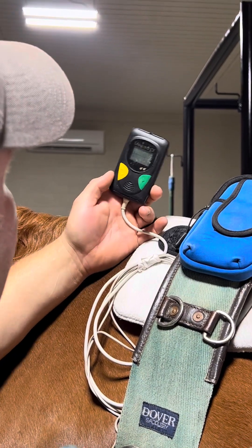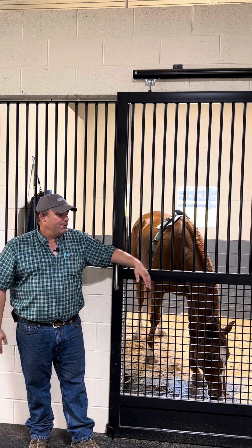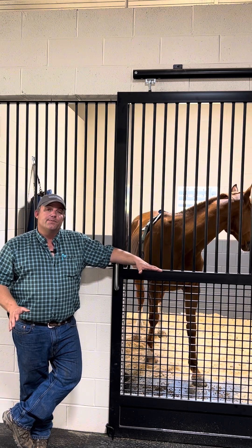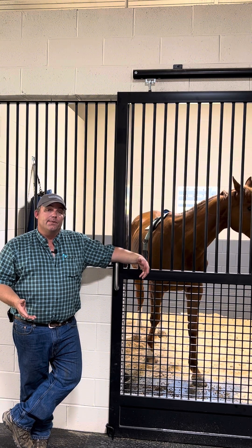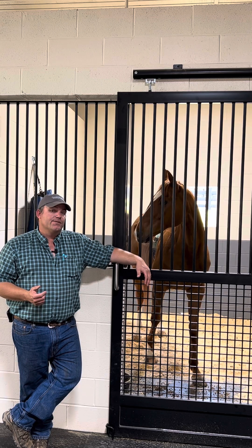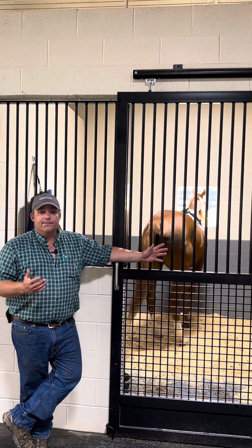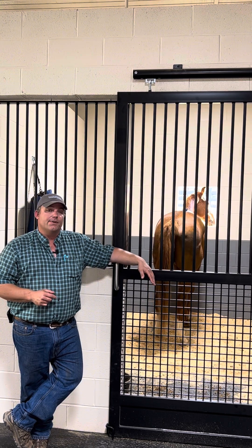We've got a great waveform, everything looks perfect. So here we are back in the stall, Holter monitor is set, we've got an ECG going. The great thing about having this service available through New Bolton is we're able to do this procedure in the comfort of our hospital. Before this, your horse would have to go to the university, with leads coming out of the horse hardwired back to a monitor — it wasn't comfortable for the horses. This will allow for a 24-hour ECG; we'll be able to detect the arrhythmia, and it'll be read by a cardiologist. As you can see, Fargo is as comfortable as he could be — no stress, no worries. This allows for a worry-free examination.